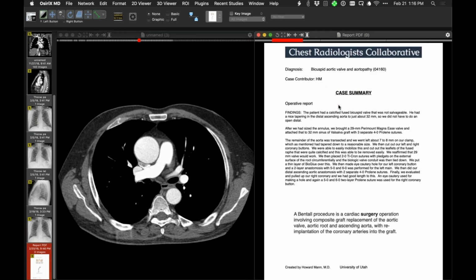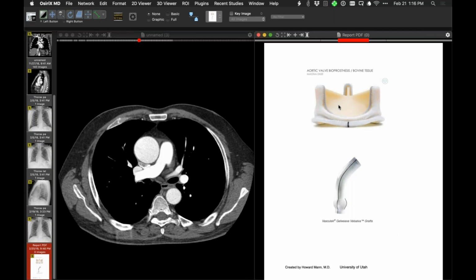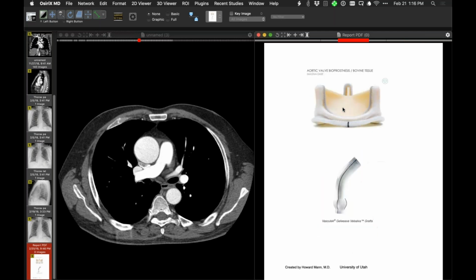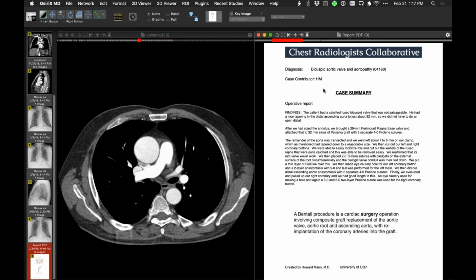And if they use the word biological, I think it's in reference to the fact that it's a bioprosthesis. And you can use a stented or a non-stented bioprosthesis inside of the Valsalva graft, but this is a stented one in this case, this particular one that they used. So that's sort of conventional surgery for dealing with this situation. Yeah, the schematics are nice.